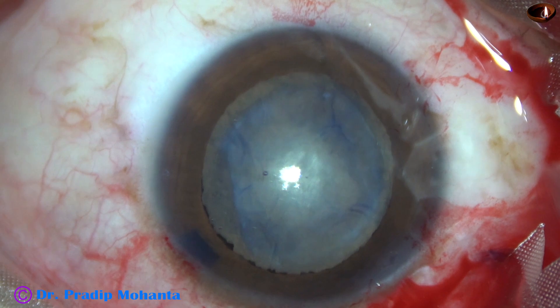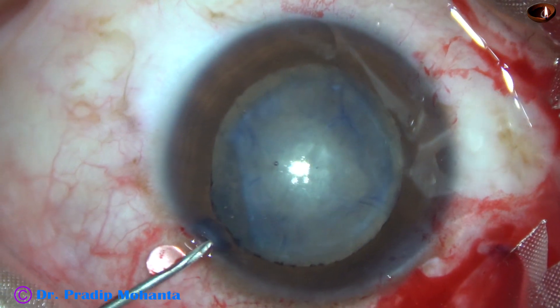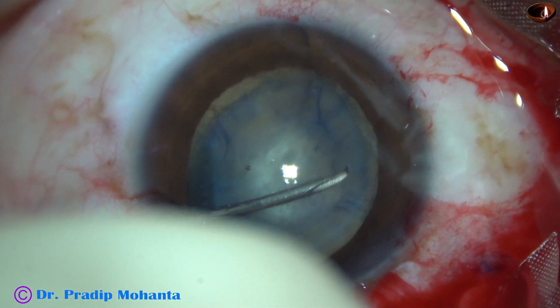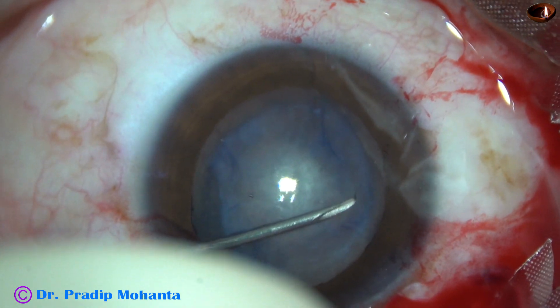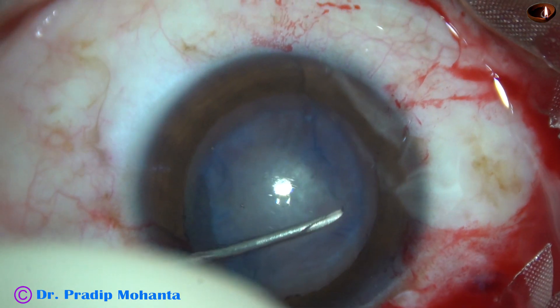Intermittently I'm injecting viscoelastic and I'm thinking what to do here. I have taken the needle again and I'm doing a cut in the capsule here — and there is a tag.